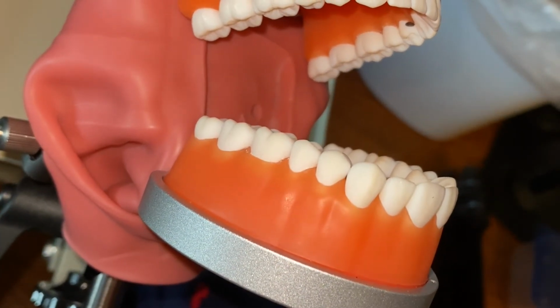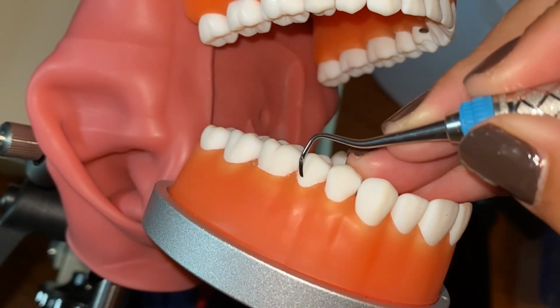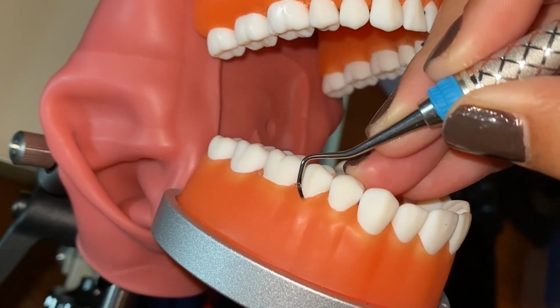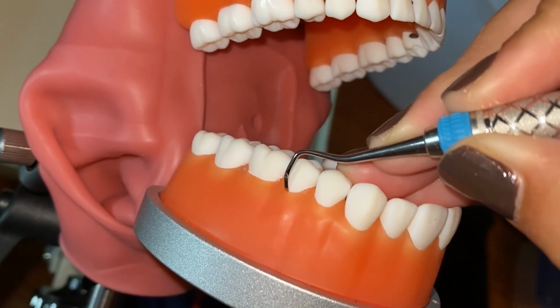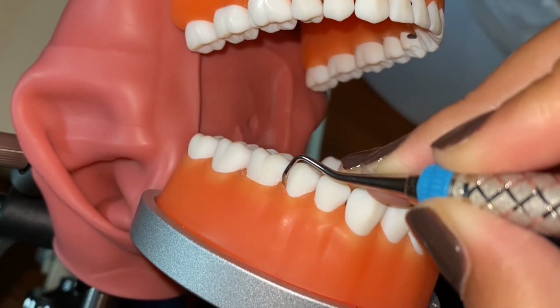Now we'll go on to tooth 13. Inserting at 0, opening up the blade, up, down, pivot in, up, down.